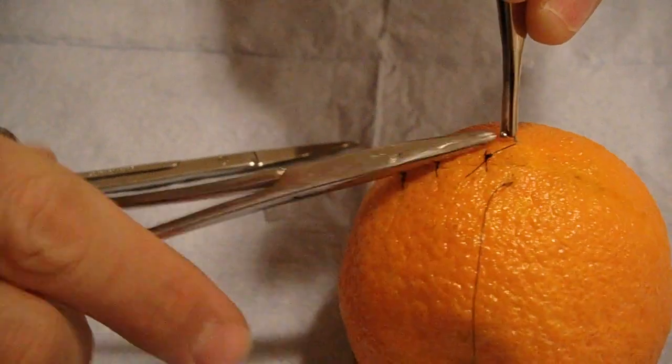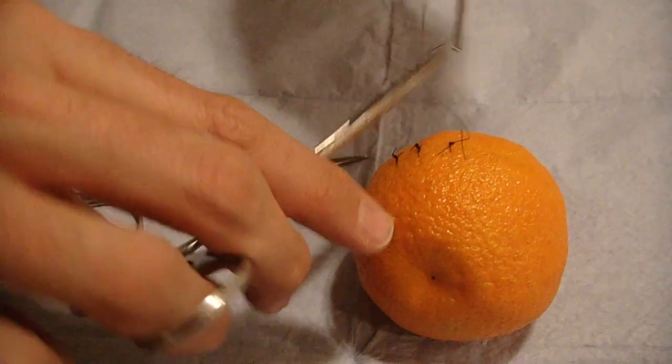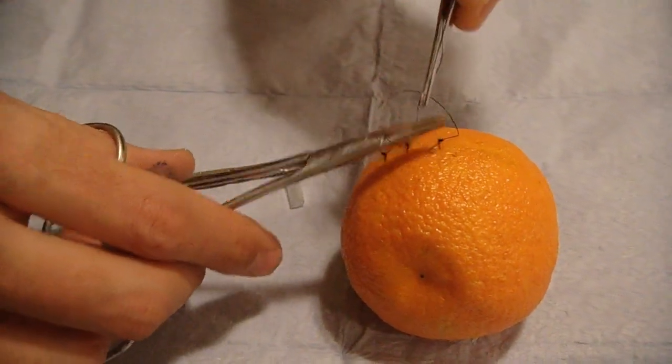Sometimes like with an HIV patient or something, I'm not going to want to really be messing with that needle.